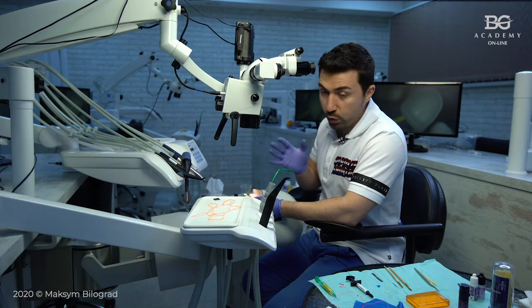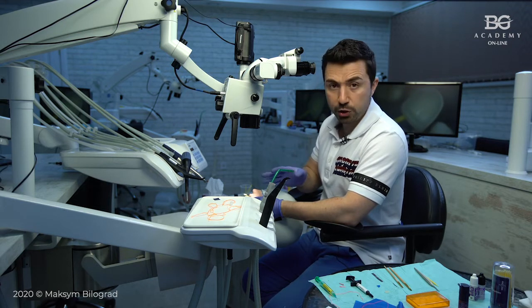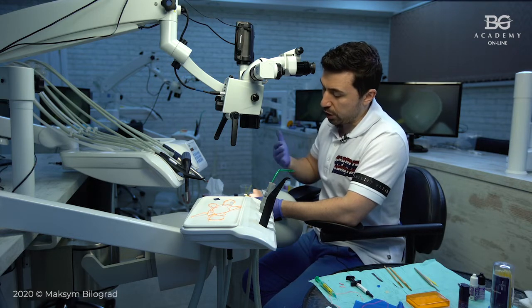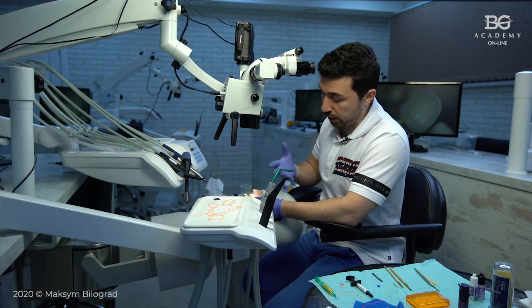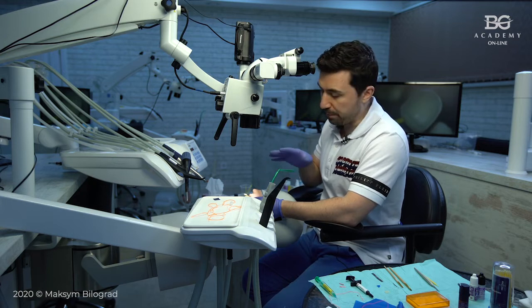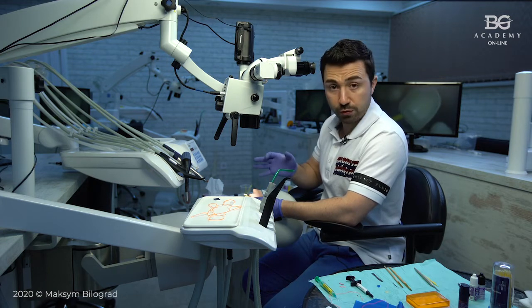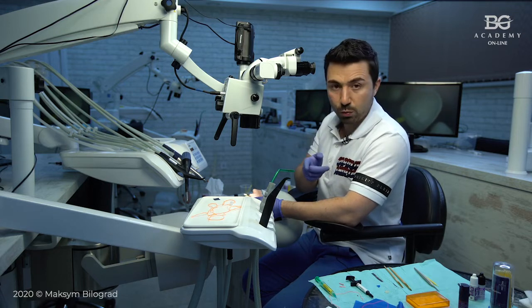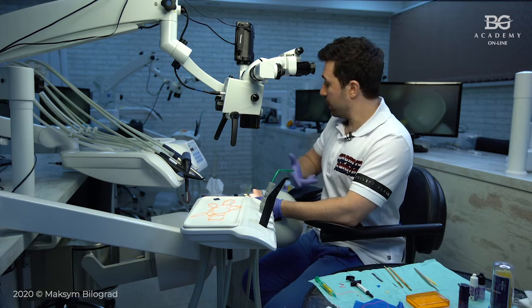Okay, so how do we remove salts? If your dental technician makes the etching, he can use a steamer. If you do etching here in clinical conditions and you don't have a steamer, after etching the veneer surface with hydrofluoric acid, you can put your veneer into an ultrasonic bath with distilled water or with ethanol for 5 minutes. Or there is another option.